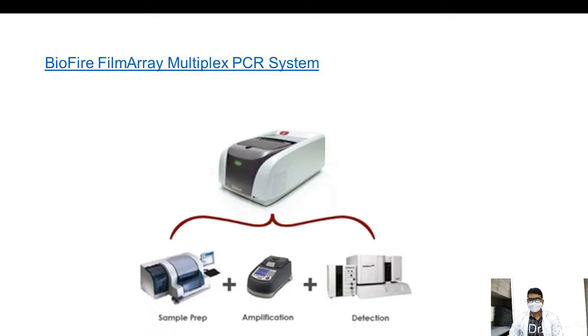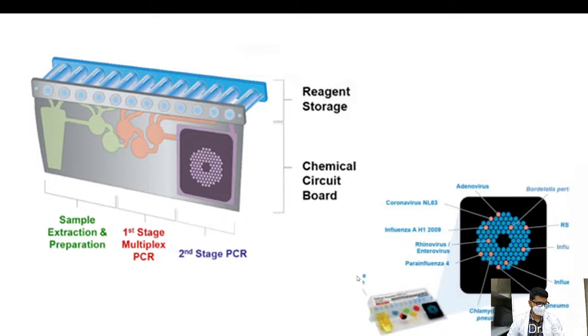BioFire FilmArray multiplex PCR system. This is the most advanced and recently developed system where the sample preparation, amplification and detection all three run in a single instrument. Here in this instrument we have all the things in a single place.